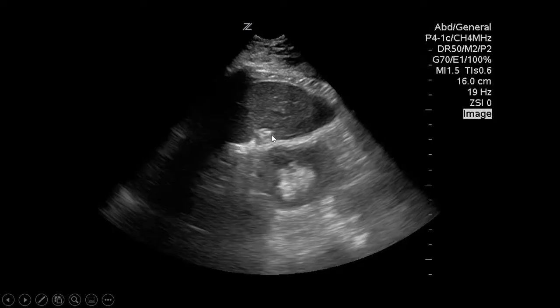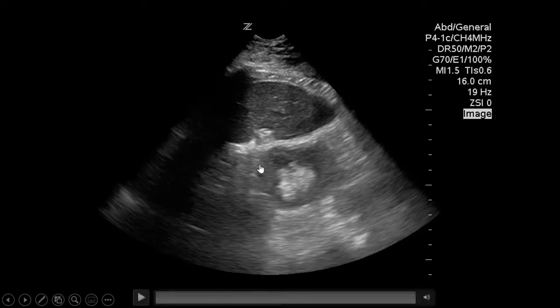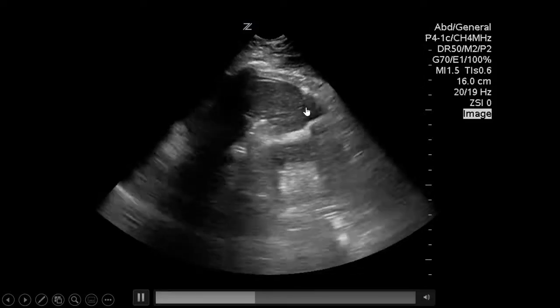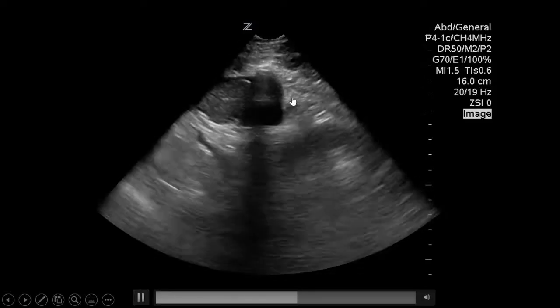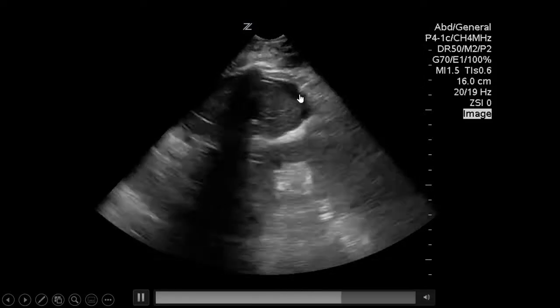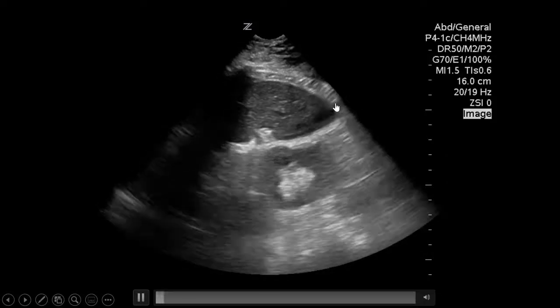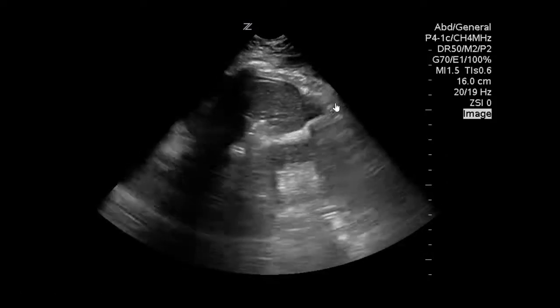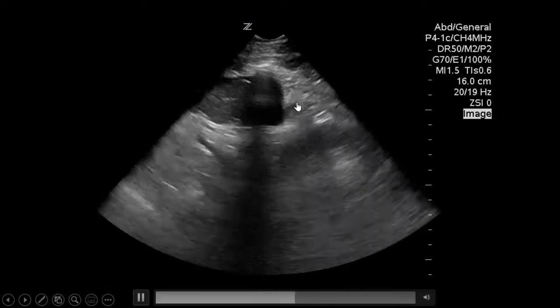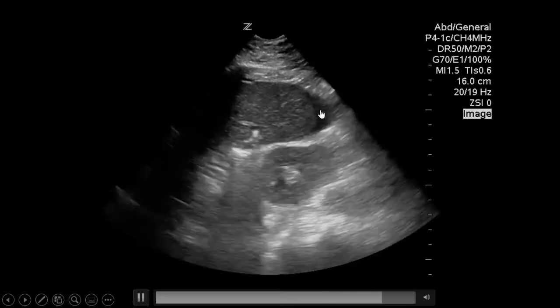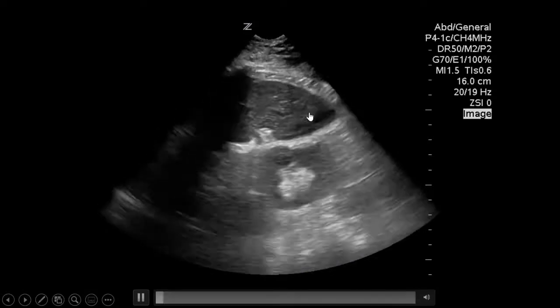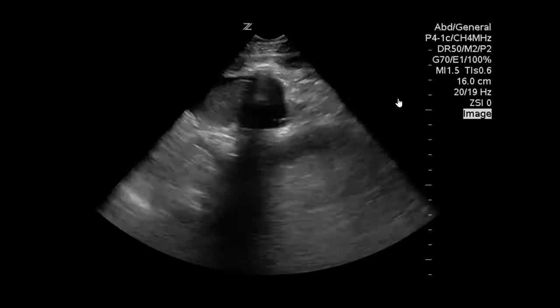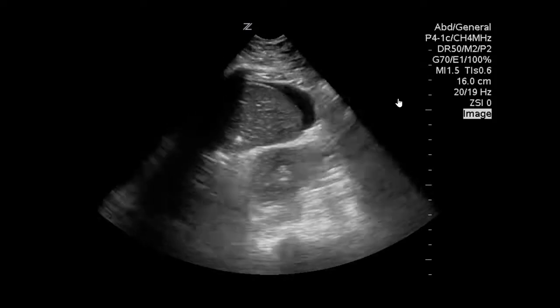It's so important to look at that caudal tip because fluid can just accumulate around the tip of the liver or the tip of the spleen - make sure you see the tip every single time. In this video, there's black just around the caudal tip of the liver, which is a positive FAST for fluid in the abdomen.